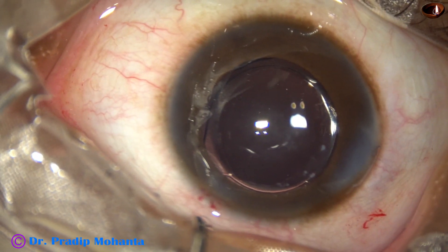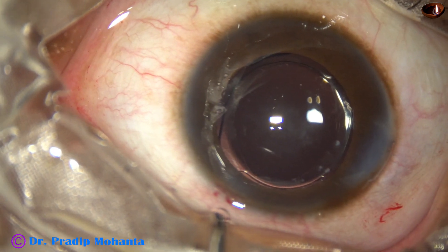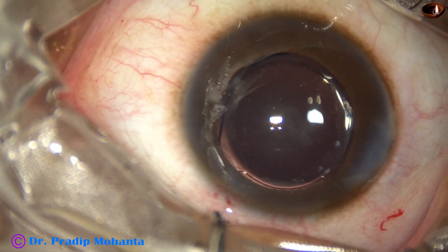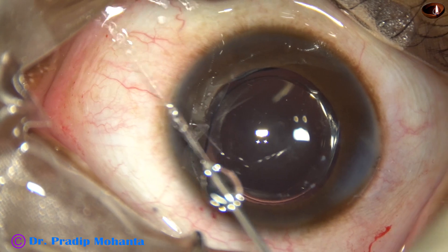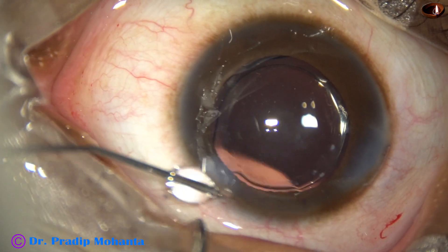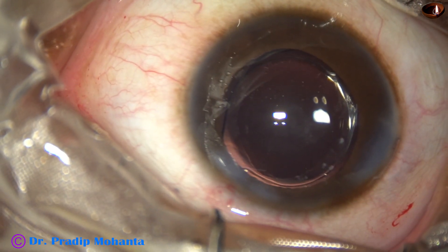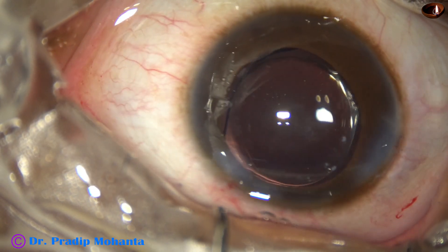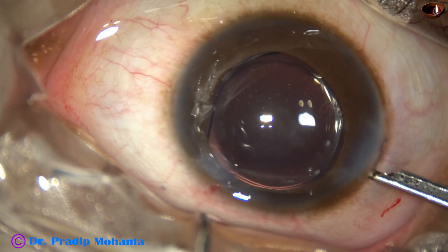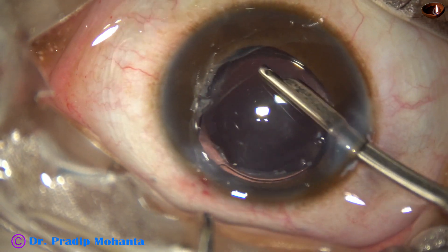And now the side port is to be closed. This is a bit of Moxifloxacin, and then with BSS, the corneal stroma is hydrated and the side port gets closed. And now a final lavage of the anterior chamber with the Simcoe cannula.